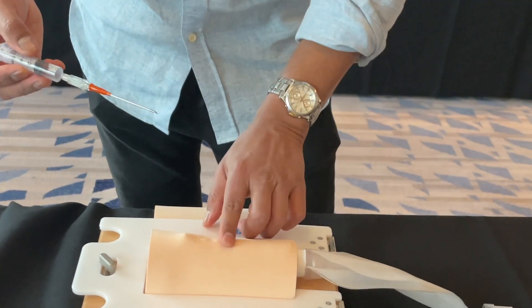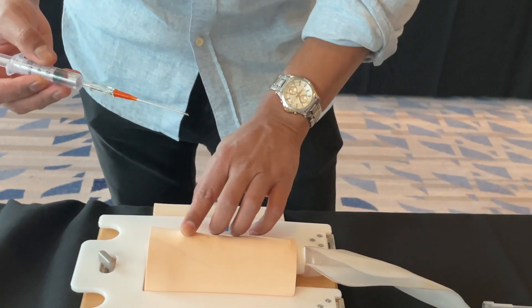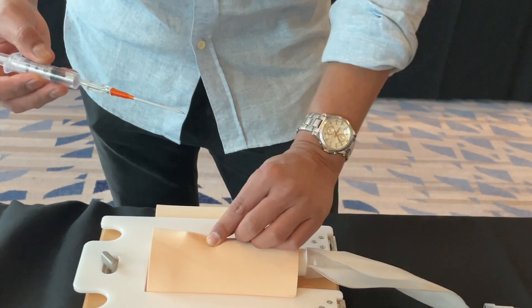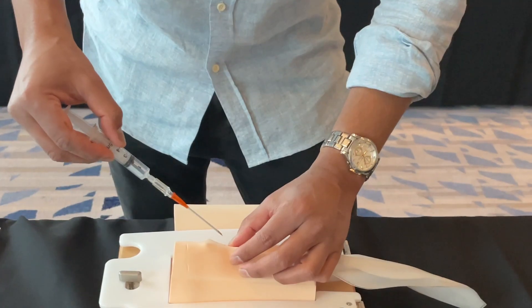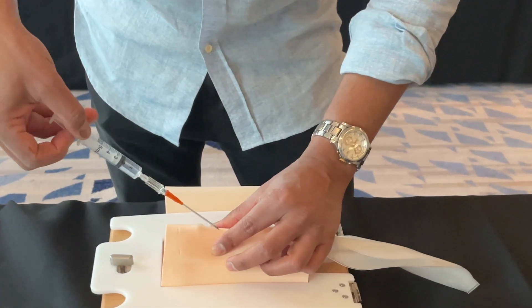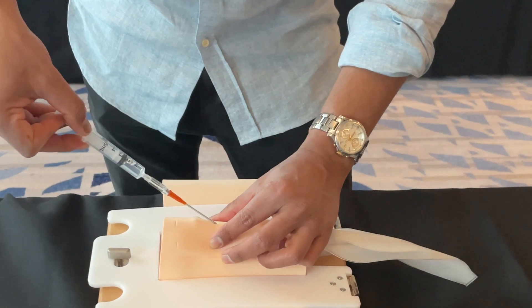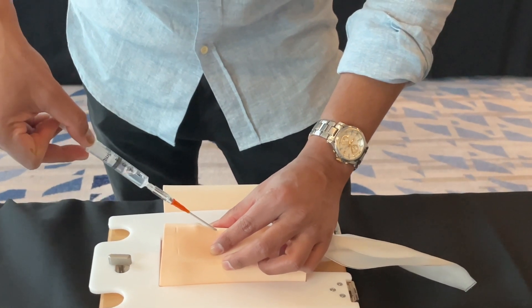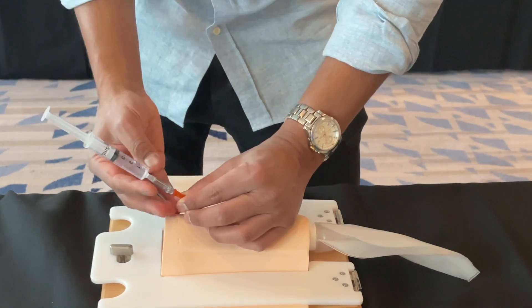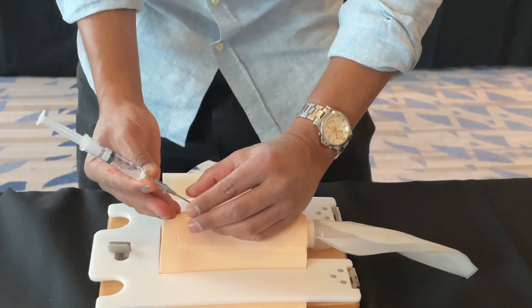The next thing I'm doing is looking for that cricothyroid membrane. Here we have the thyroid prominence and the cricoid ring, and in between is the cricothyroid membrane. I use about a 45-degree angle and get my grip on the cannula. As I'm inserting, I aspirate, and as soon as I get positive aspiration of air, I stop and I really stabilize my device and pass the cannula down.